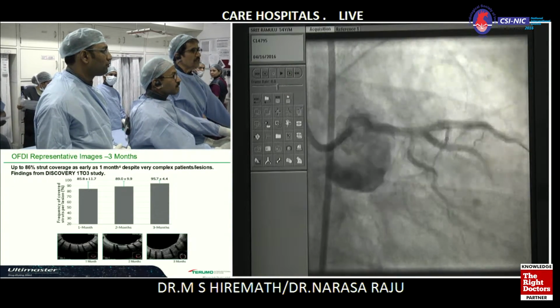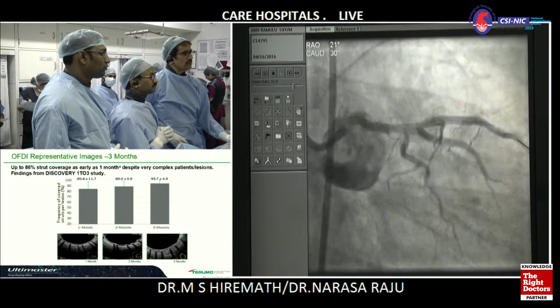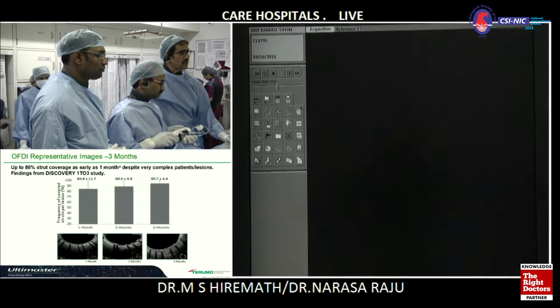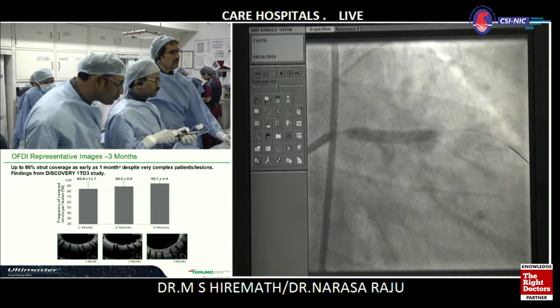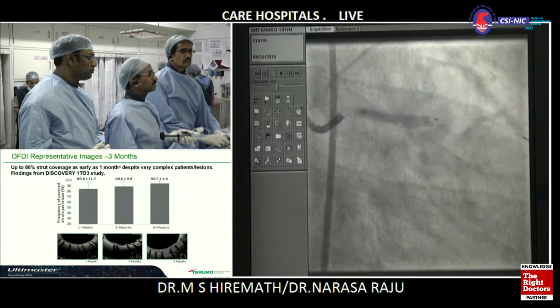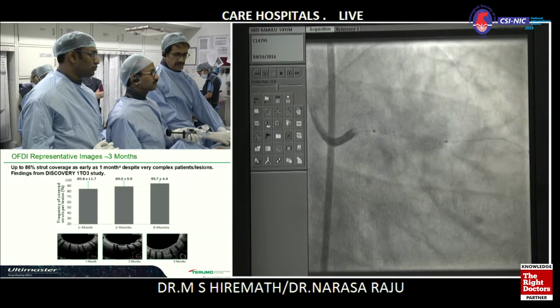Okay, so it's 4.0, and see, we have to go very high on the proximal portion. Yes, I think we're okay. We go up quickly to 6 and gently to 8. Okay, at 10, stop. 10, 8, enough. So this is a 4.0 going to 8 and 10.